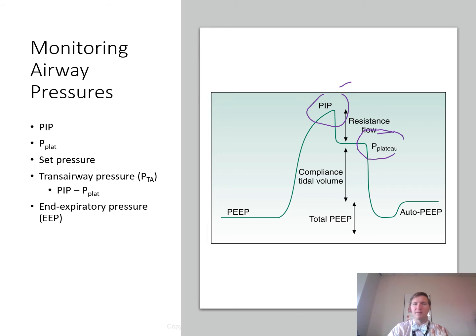It is important to remember that plateau cannot be measured accurately if the patient's actively breathing. So if they're breathing 40, 60 times a minute, I'm just giving you numbers, right? If they're actively breathing during that measurement, it's not accurate. Or the machine nowadays may say unable to perform. So if the patient's actively breathing, you may not be able to get a plateau pressure. That's something to pay attention to. It cannot be measured accurately if the patient makes active respiratory efforts. If they have a high respiratory rate or resist the inspiratory tidal volume pause, it makes it difficult, but not impossible, to obtain on spontaneous breathing individuals as well.